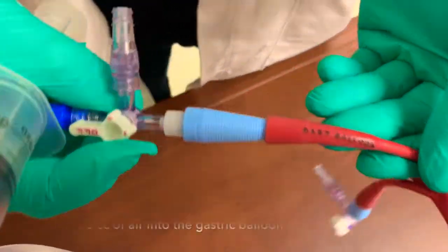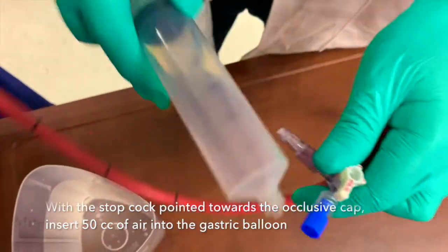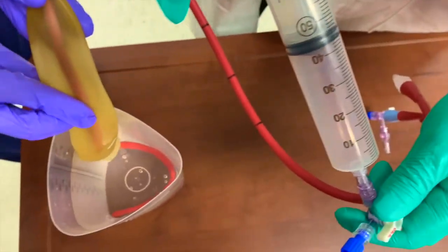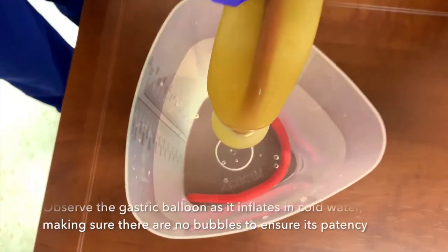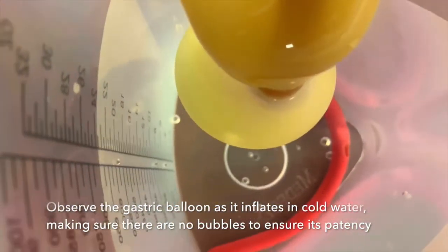Next, ensure the patency of the gastric balloon. With the stopcock pointing towards the occlusive cap, insert about 50cc of air into the gastric balloon. Observe the gastric balloon as it inflates in cold water, making sure that there are no bubbles to ensure its patency, then deflate the balloon.